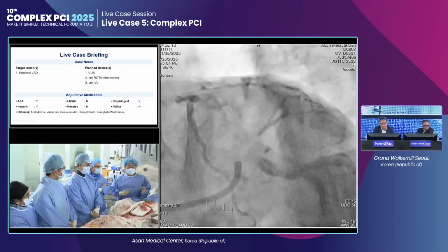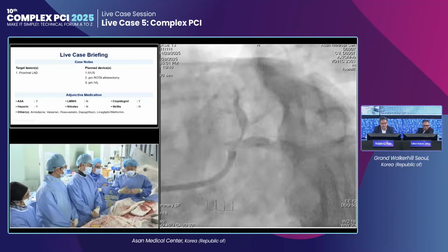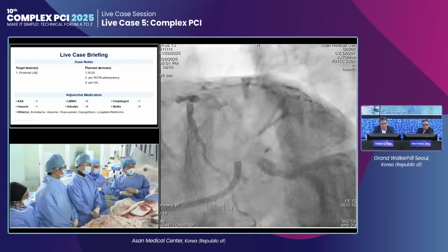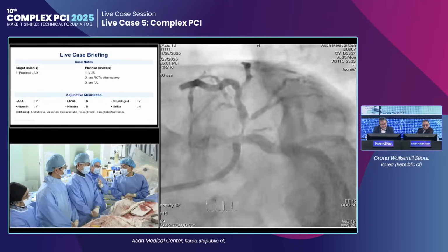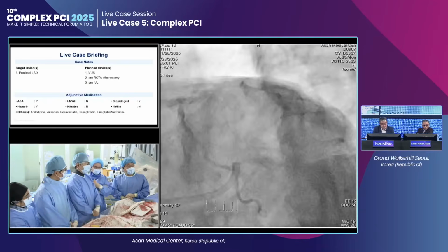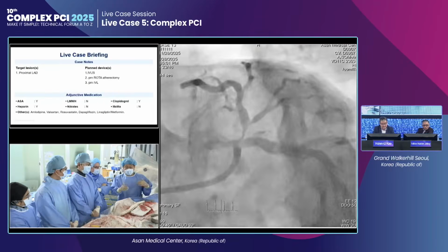Really, I'm very excited to hear the new strategy in terms of balloon inflation, 2 millimeter balloon, and rotablation for big artery calcified regions. I want to try that. However, in this case it is not needed. Honestly, with lithotripsy, this procedure is less important. But if you have economical concerns, maybe it is an option. As Antonio suggested, we want to do just the NC balloon first.